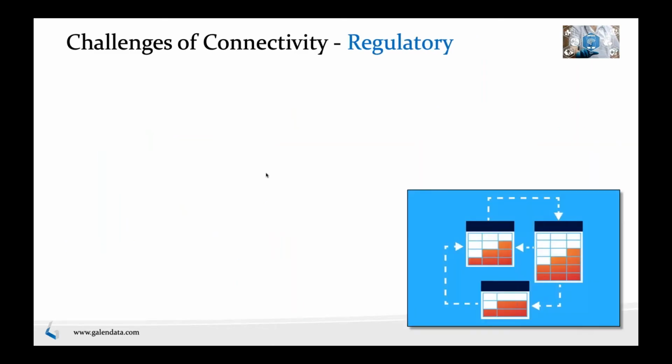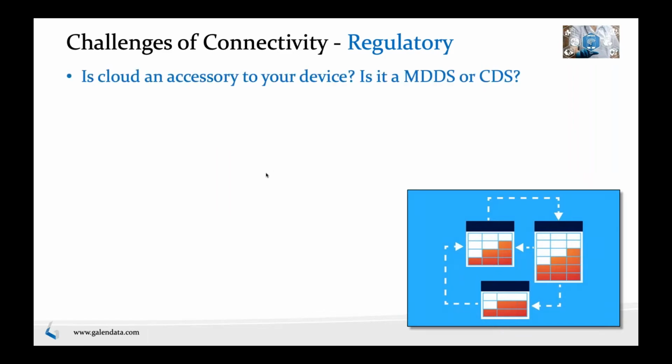Next, I want to talk about the regulatory challenges that you get once you decide to have cloud connectivity. The question is, how do you deal with the cloud? Is the cloud an accessory to your device, or is it a medical device data system, or is it a clinical decision system? All those questions come up and you have to deal with them. Adding additional things to your offering obviously can delay your regulatory filing, so go-to-market strategies can be impacted by the decision on what to do with the cloud.